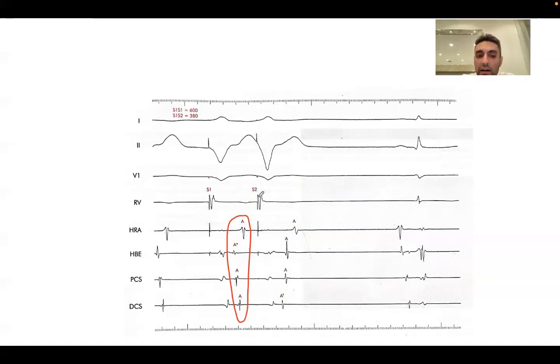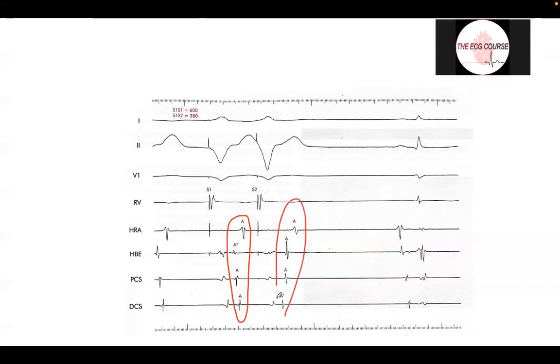Excellent. Now with this S2, is there atrial activation? Yes or no? Yes, there is. Is it different than this? Yes, there is a change. It is a bit later at the HIS. Now, where is the earliest A? Earliest A is in distal CS.